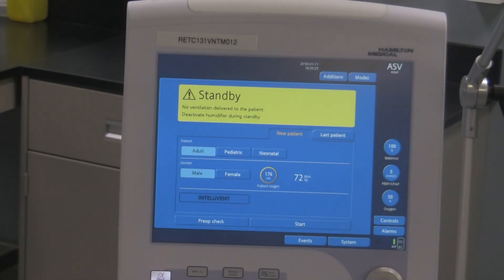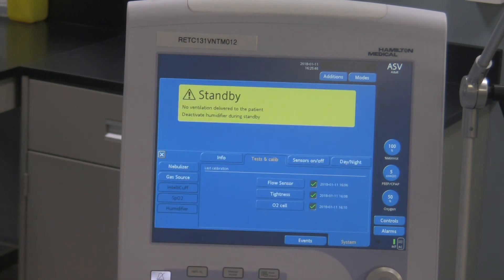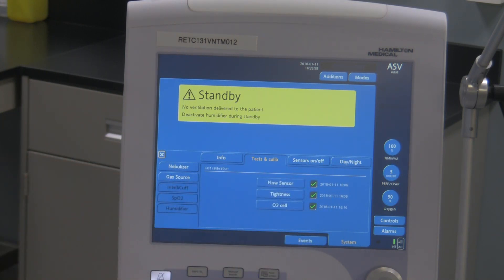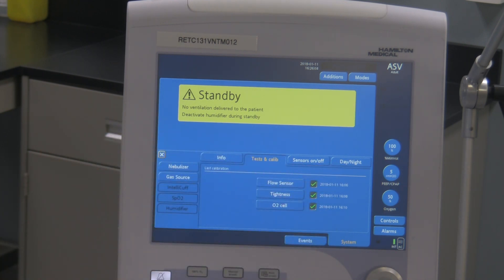I'll back this up a bit so you can see — it gives you a bunch of options. The ventilator, when you turn it on and does that little startup check, it stays in standby. The pre-use check option is right down here where it says pre-use check. To activate it, simply touch that tab. It brings you into a new menu with the checks: flow sensor, followed by tightness, as well as O2 cell. On the right-hand side it shows three green check marks because the last time the checks were done they all passed, and it tells you the date.